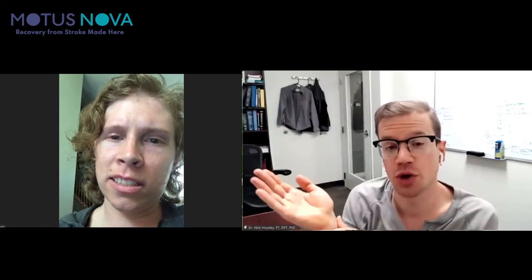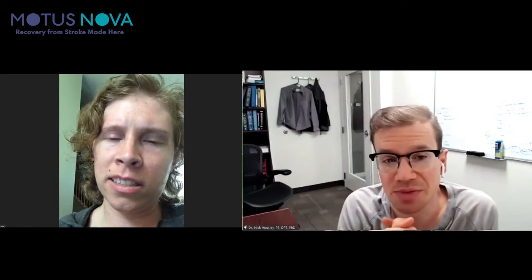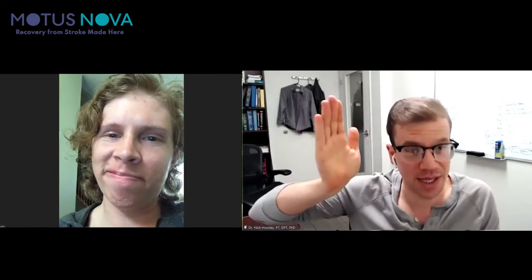Yeah, so that's a good question. So this means that we have to evaluate you from a different starting position. And this is why during these assessments that I do, Amanda, you'll often see me ask people, when I go from an extended position, I'll have them then go down from an extended position into a flex position.